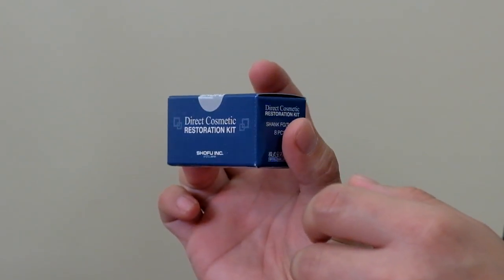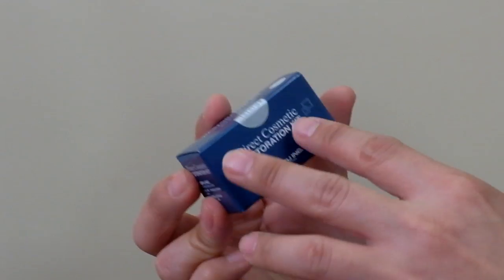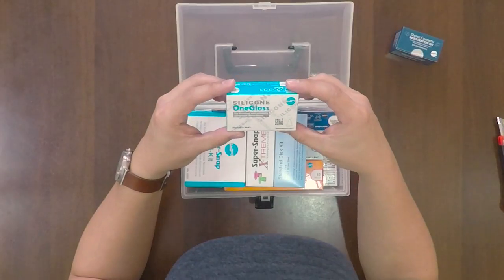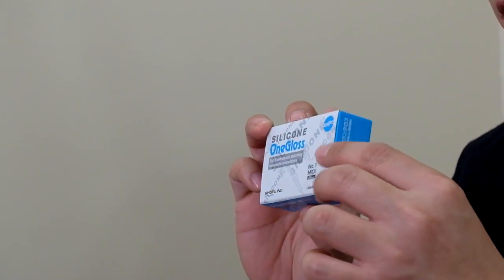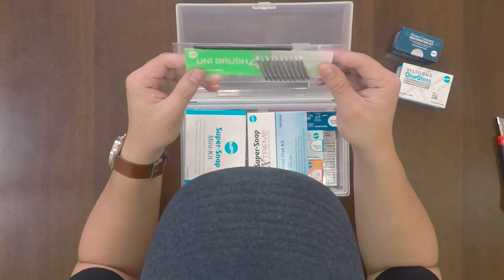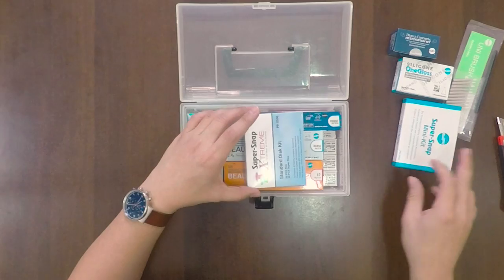This is the burr system that they have that goes with this kit. It comes with eight pieces. The silicone one gloss — it's the finishing system and polishing for the restorations. We have the UniBrush, of course, the Super Snap. Oh, they even added a Super Snap Extreme.